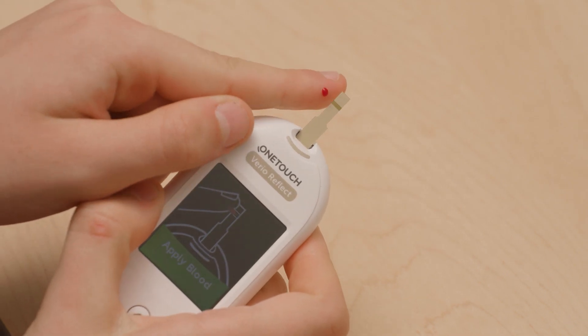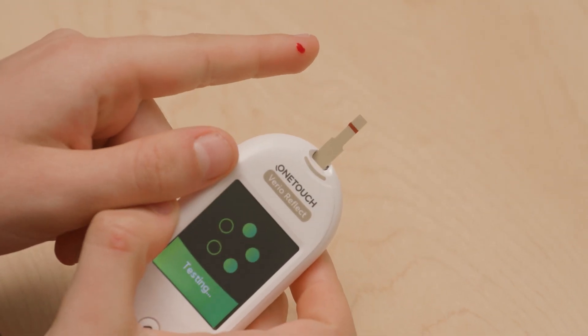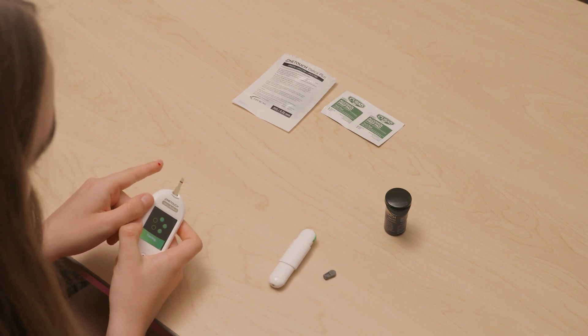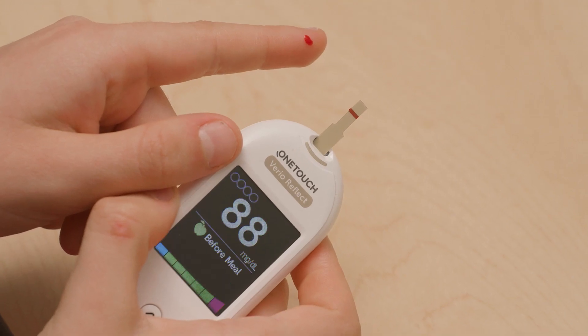Touch the blood sample to the test strip. On these strips, the line is sideways; on other test strips, the line is up and down. Look at your strips before using to see where the line is to touch the blood to. The meter will count down then show you your blood glucose number.